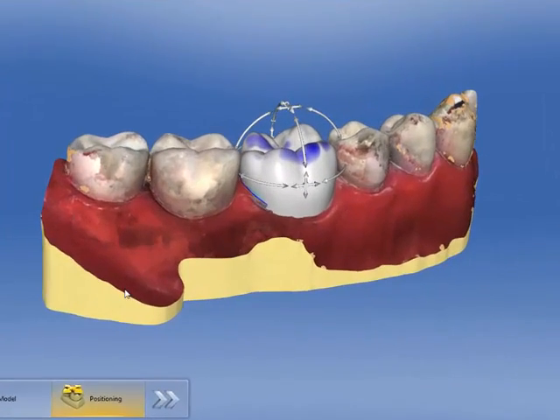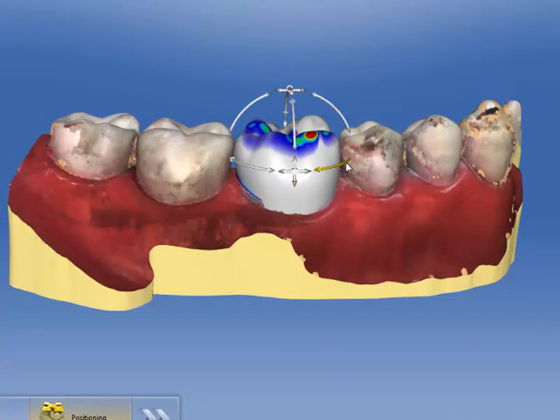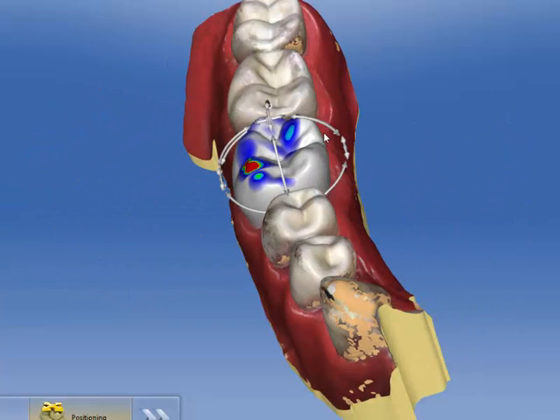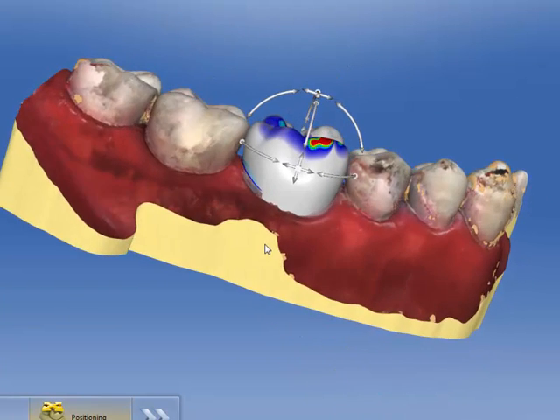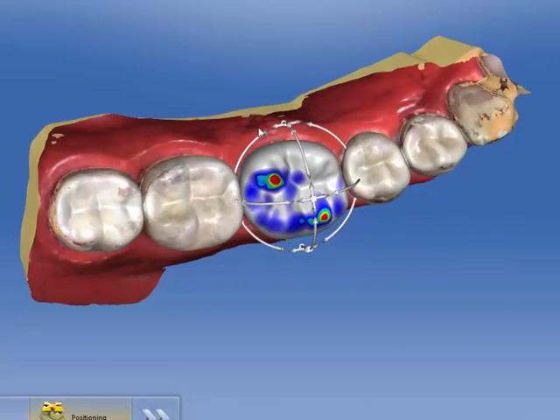What this allows me to do is go to position and position this tooth anywhere I want, and it will not take into account the opposing arch. So if I wanted to tilt these and move it all around, however I think this would fit into the arch better, I can do that.